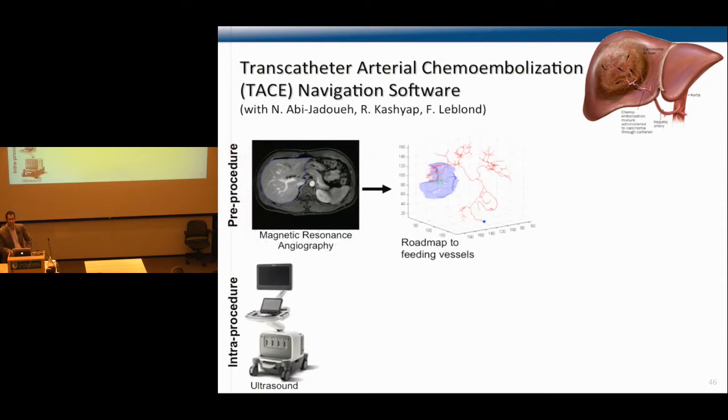We need to adapt the segmentation algorithm to be able to process more diffuse tumors. Sometimes you'll also have multiple tumors that collide together. So it's definitely a different challenge than treating focalized tumors like metastases. In terms of the registration problem, depending on what you use in terms of structure, it could be fairly similar. But the therapeutic approach will be different, and the segmentation of the tumor will also be different.